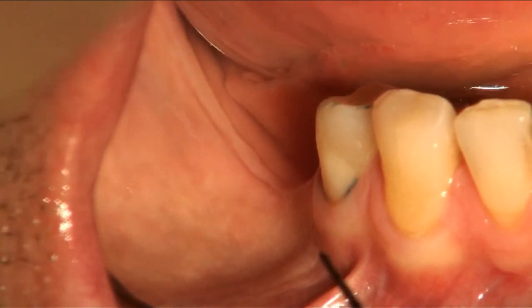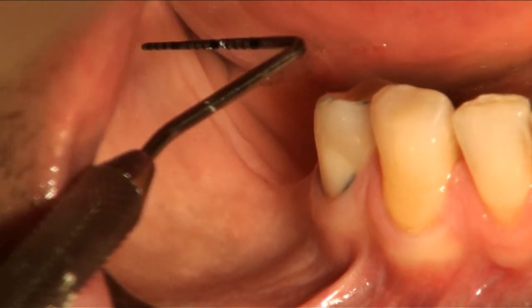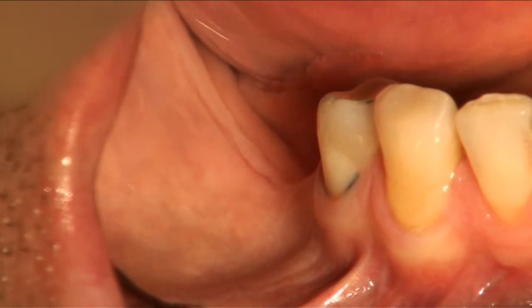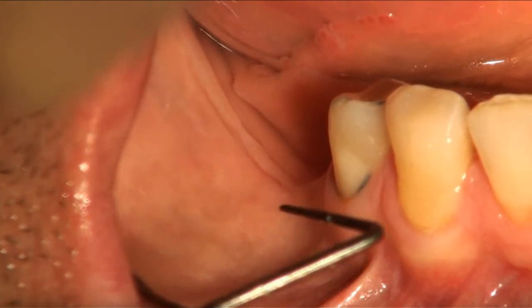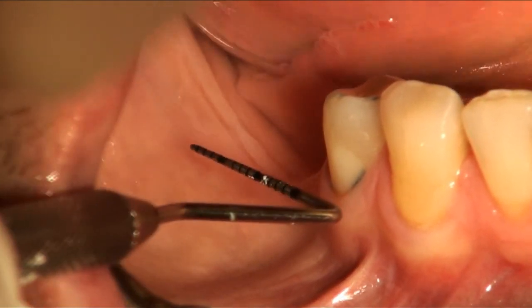Before the ridge augmentation, using an autogenous bone block from the mandibular ramus, we plan to implant an Osmed tissue expander in order to expand the alveolar mucosa, because we want to facilitate the primary closure of the flap.